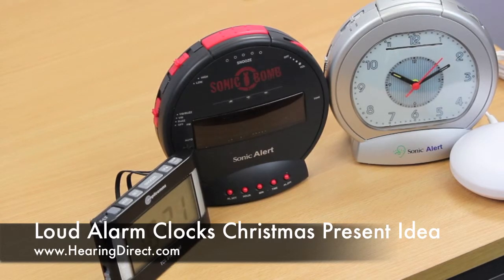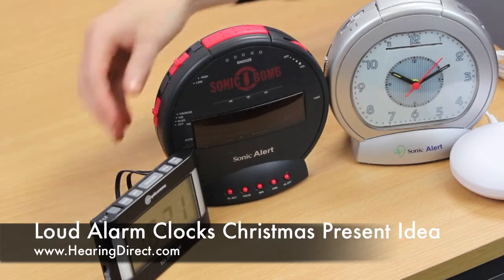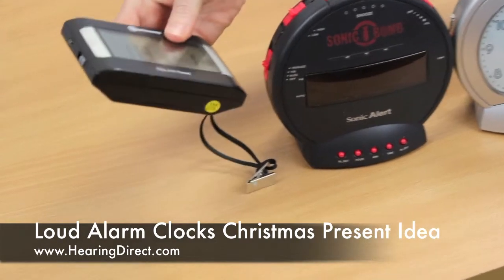You can have digital alarm clocks or analog alarm clocks, and of course a more portable version in the form of this little travel alarm clock.